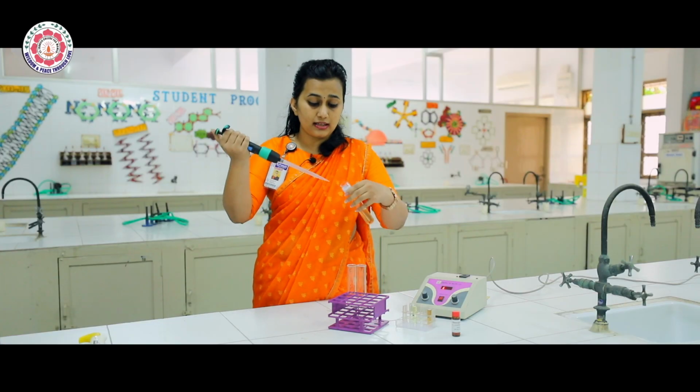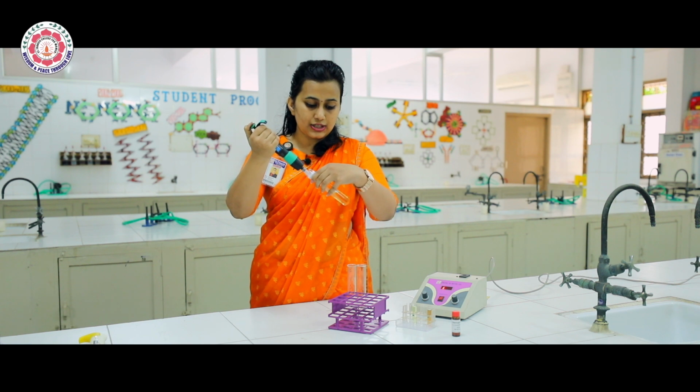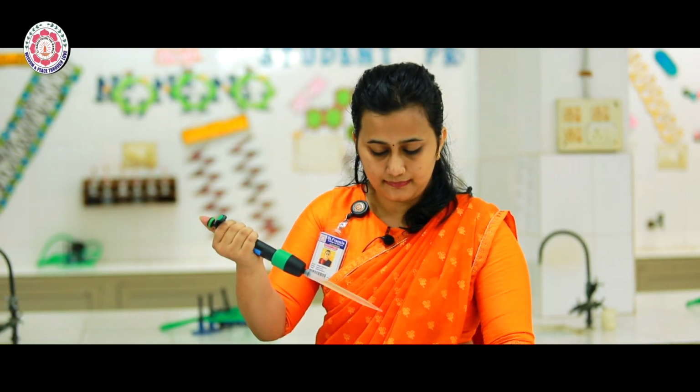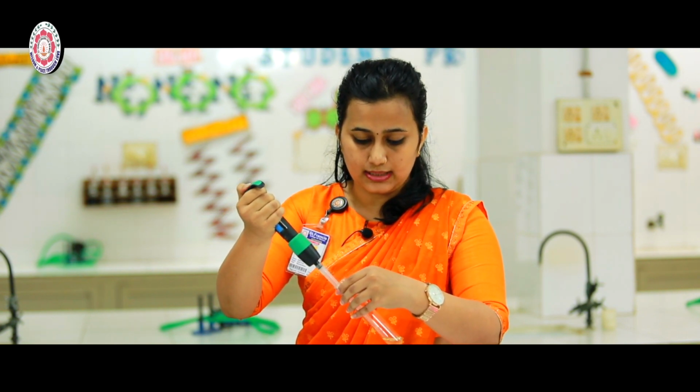As I told you earlier, cyanide is the key component in this reagent, so there should be no mouth pipetting. So 5 ml of the Drabkin's reagent is added into both the test tubes.